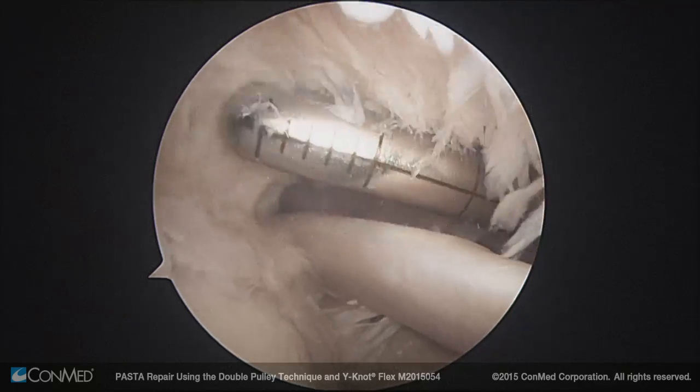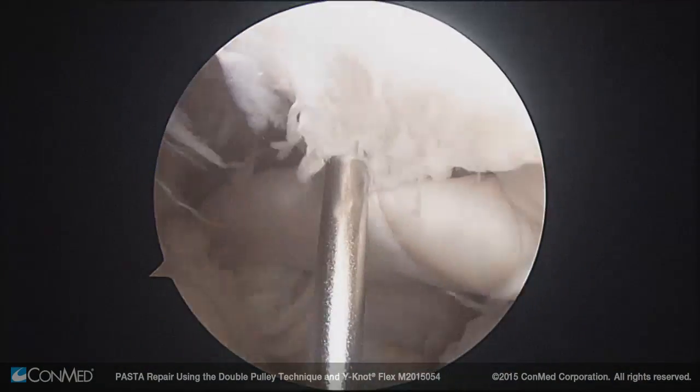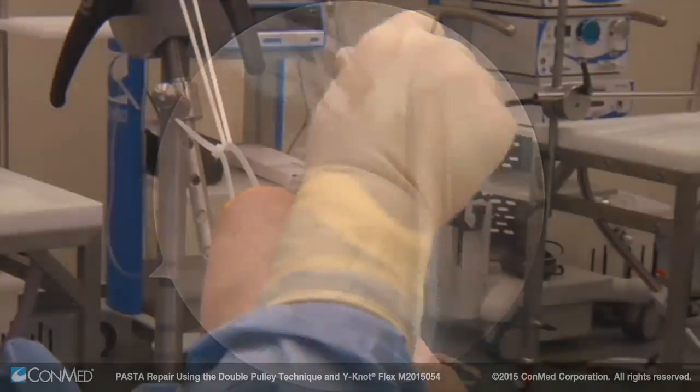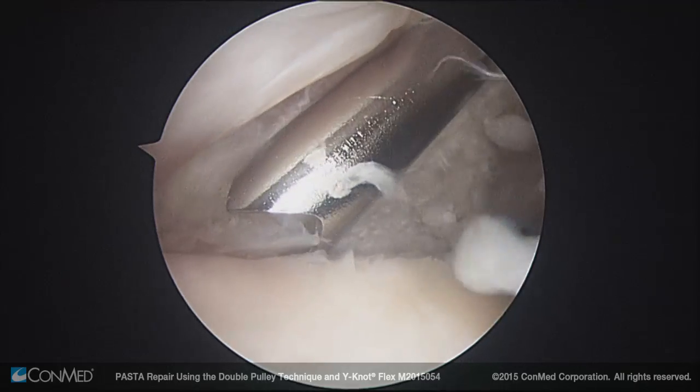After proper preparation of the footprint and tendon, the location of the first transcutaneous anchor is found using a spinal needle. The guide wire and cannulated switching stick are used to aid in the insertion of the t-handle drill guide through the intact tendon and against the bone.